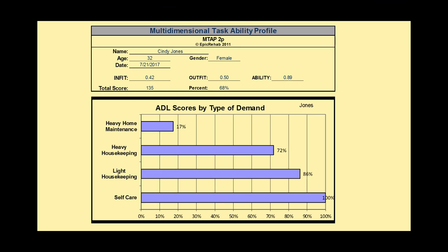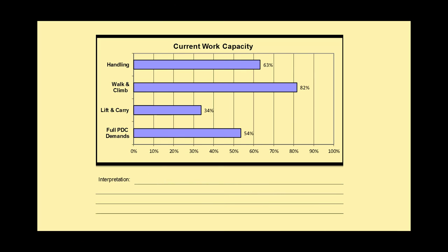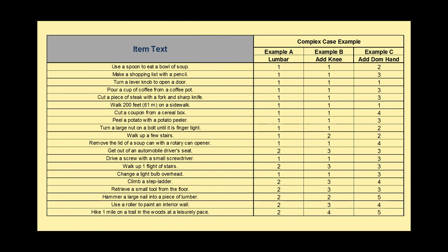To wrap up our tour of the MTAP analytics software, let's look at the final report section. The top half of the report provides basic information: Cindy Jones, 32 years old, female, the date of the evaluation, her infit score and outfit score, her ability score, her total score, and the percent of her rating of perceived capacity. Below that we see the ADL scores by type of demand and her current work capacity. There's also a section where we can record our interpretation of these data.